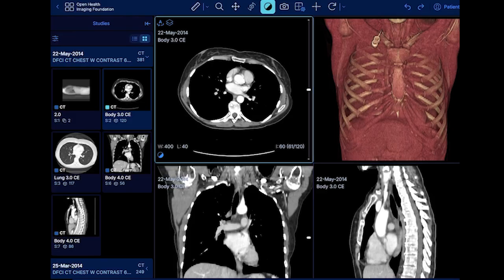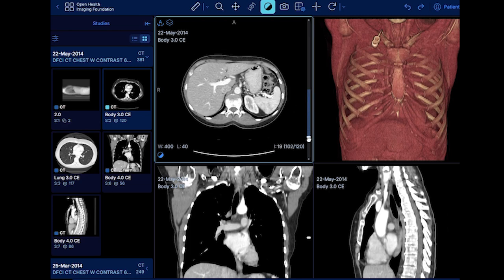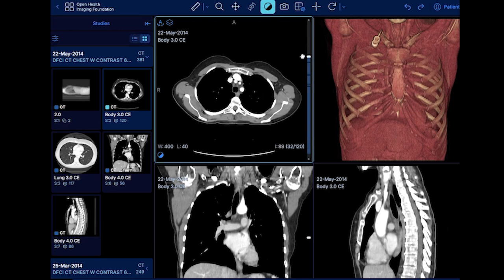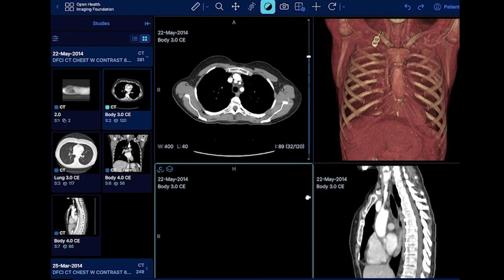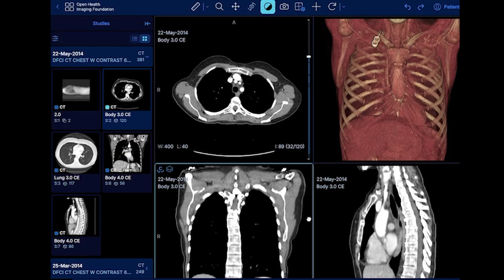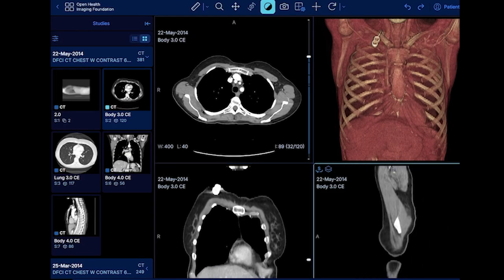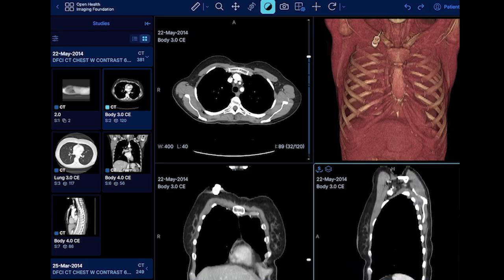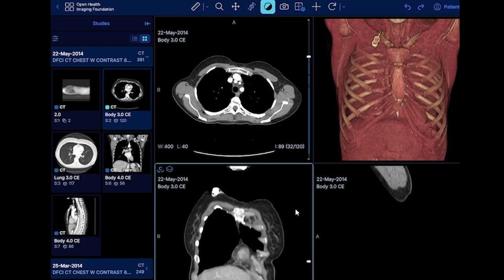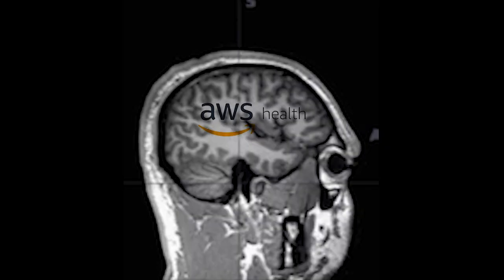AWS HealthOps replaces an ungoverned imaging handoff with a controlled cloud workflow. Trusted hospital and specialty imaging partners authenticate before uploading, invalid inputs are quarantined, clinical source data stays protected, and every important step leaves an audit trail. The result is a reusable, low-cost foundation an MSP or hospital cloud team can operate behind a clinician-friendly portal, so authorized users can work with approved imaging and visualization assets without needing direct access to AWS or the original clinical data.